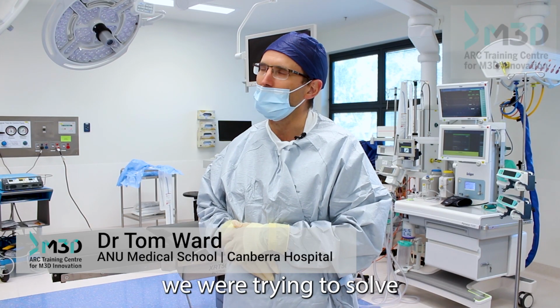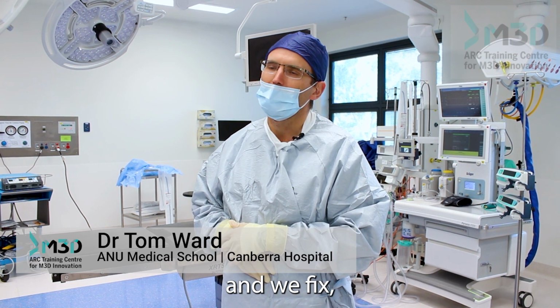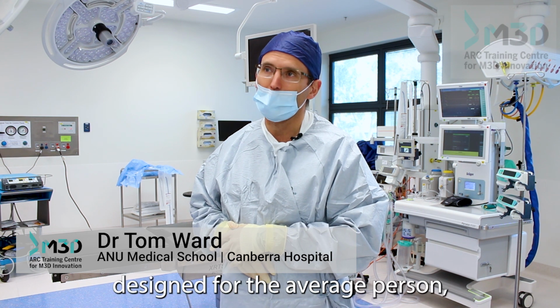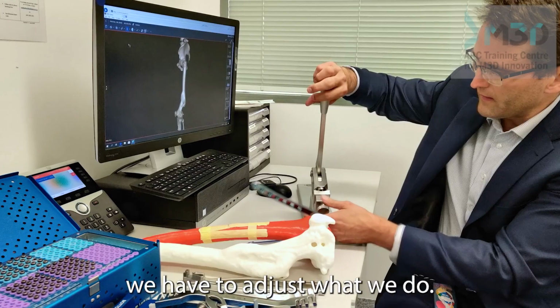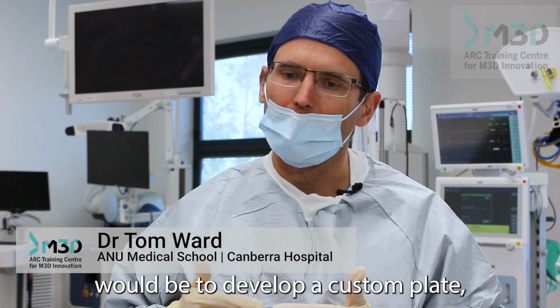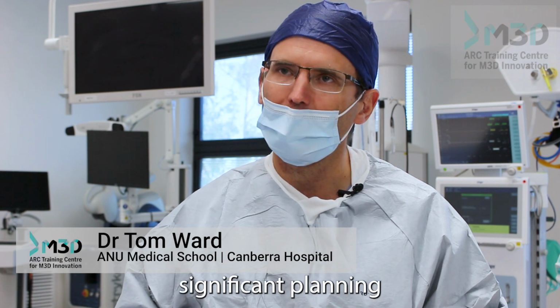So the problem we were trying to solve was when we have complex fractures that we fix, we use plates and screws to fix them, and they're designed for the average person, which means that they fit almost nobody, and that slows us down. We have to bend plates, we have to adjust what we do, and a better solution would be to develop a custom plate which is contoured to an individual patient, and that requires significant planning and manufacturing capabilities to achieve that.